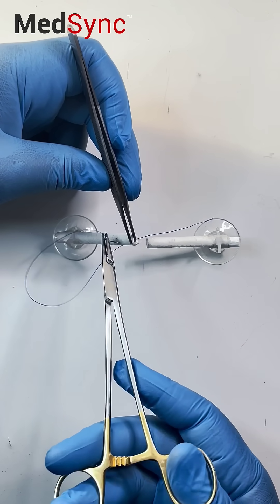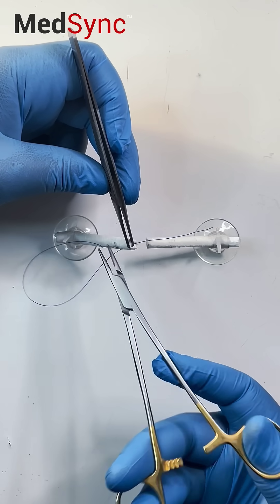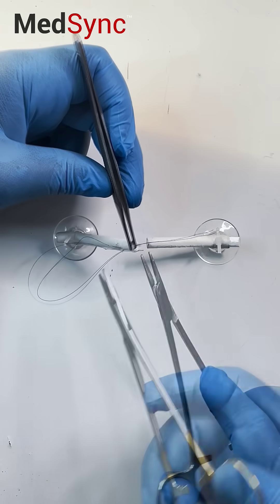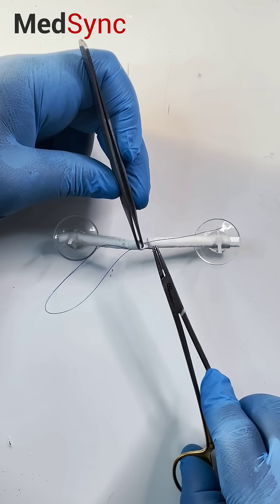On the forceps, rotate the needle, don't force it. Once you're through, pull.